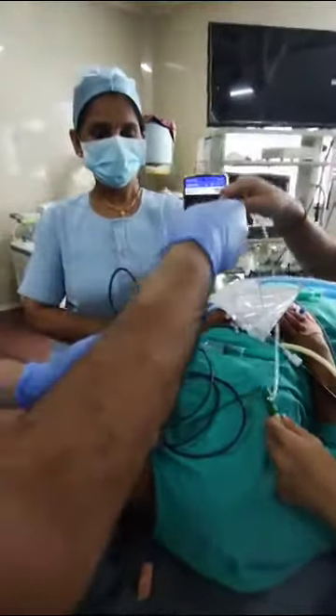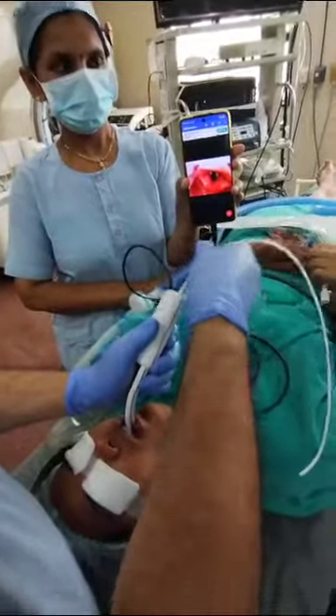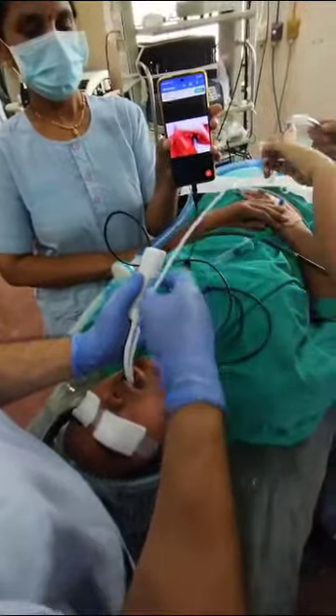Once the vocal cords are visualized, we introduce the bougie inside. See — the bougie is entering into the larynx.